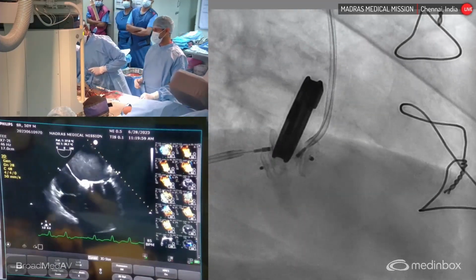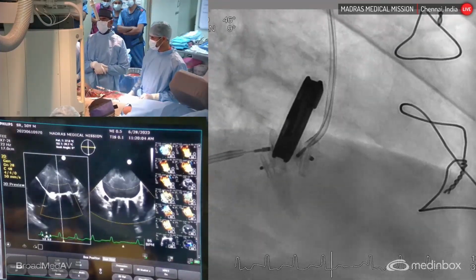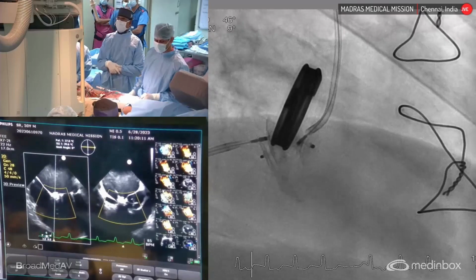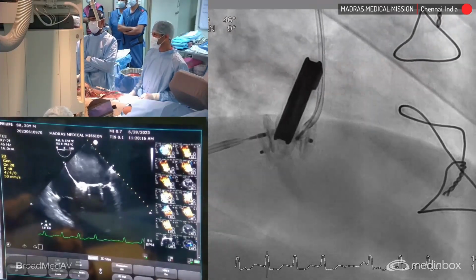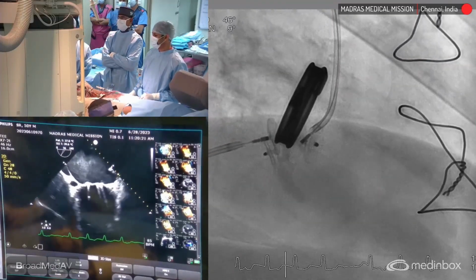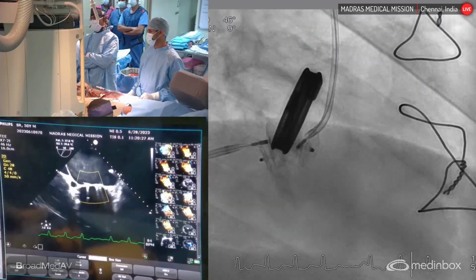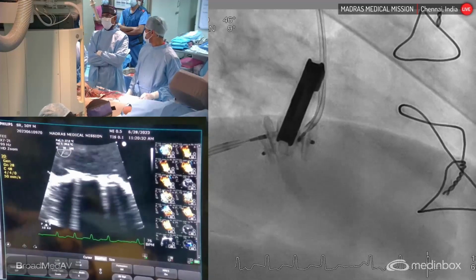Okay. So now I am taking a cine run. So we are able to see that this screw end is completely here. Now let us see the 2D. There's a lot of spontaneous contrast. I would like to now see the valve disc, whether it is moving perfectly well, because clearly the patient is in atrial fibrillation. Yeah, the valve leaflet mobility is normal. It looks normal.